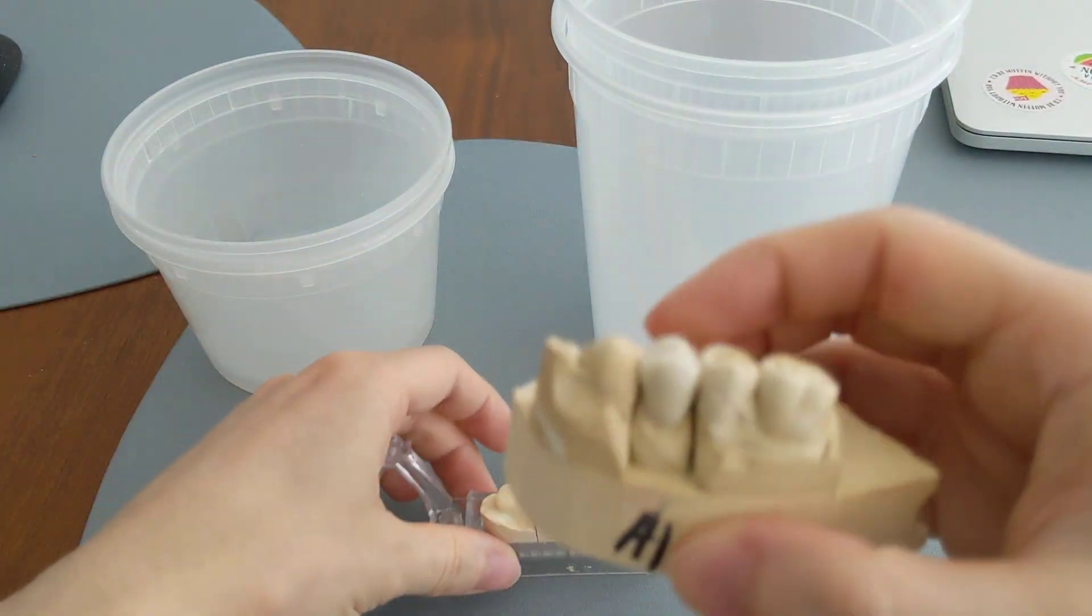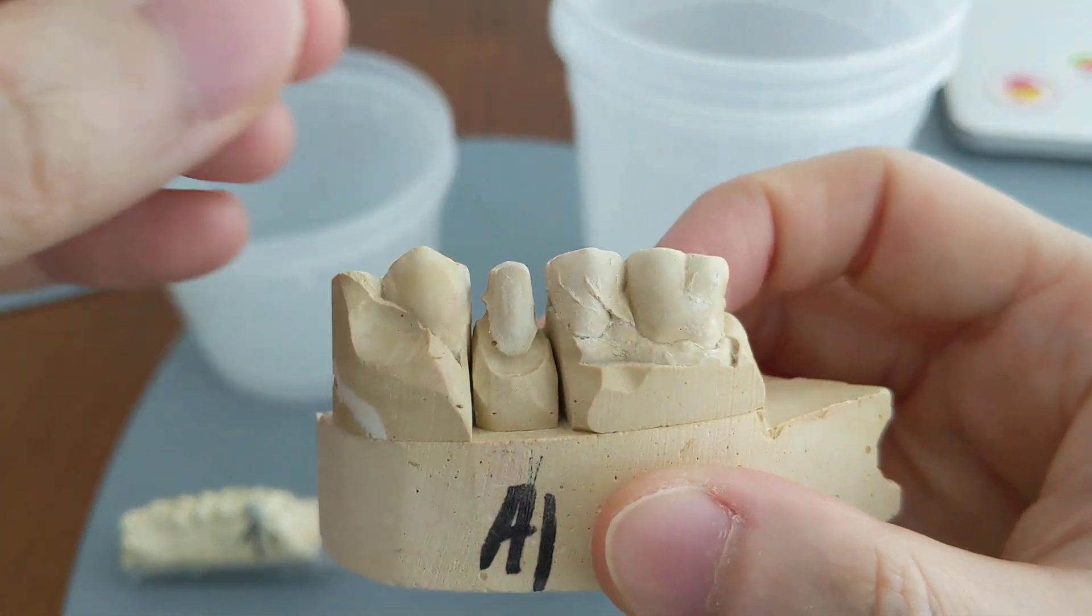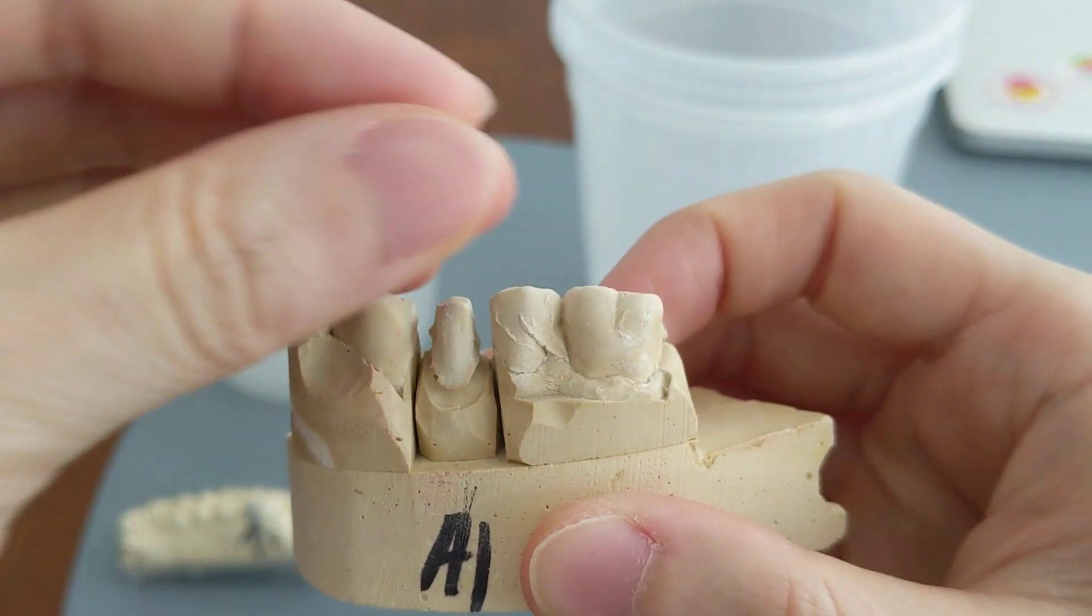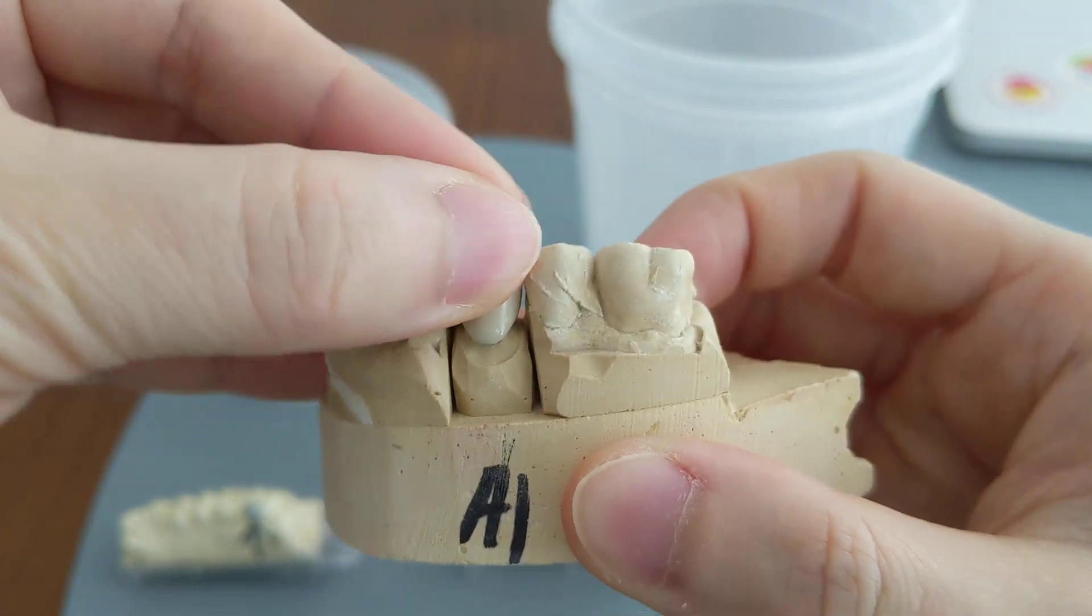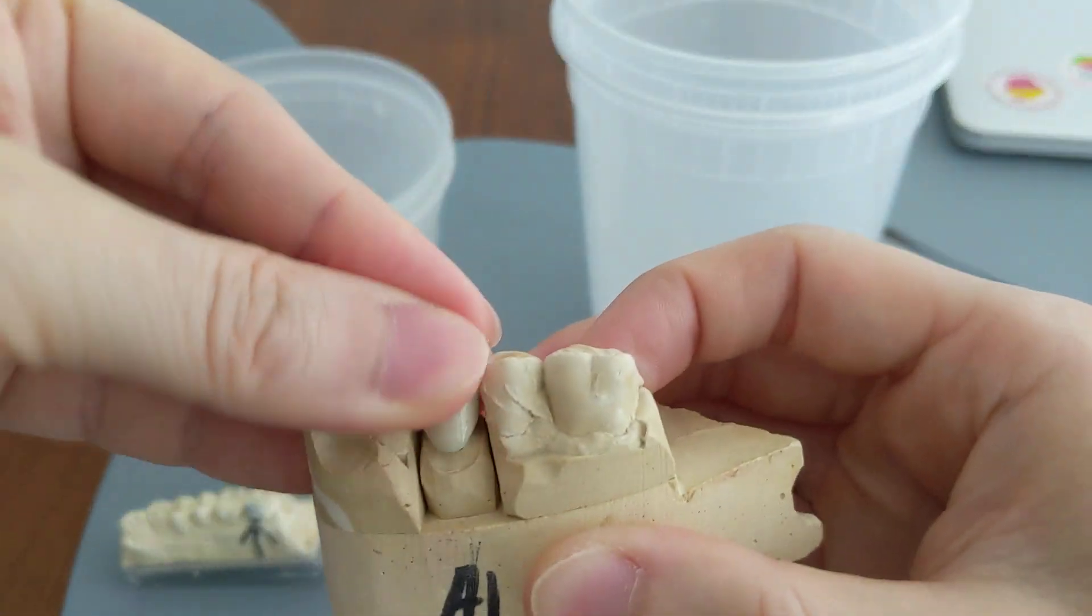And here we have a crown that is a lot taller. You see how it's taller on this one? Because it's taller, it's more difficult to dislodge it to the side.